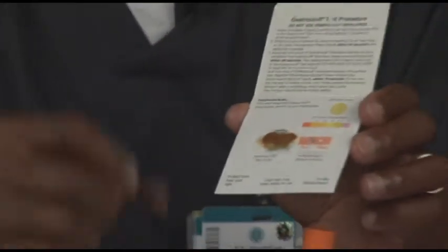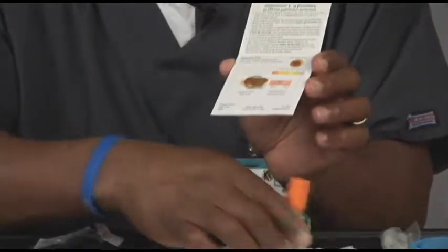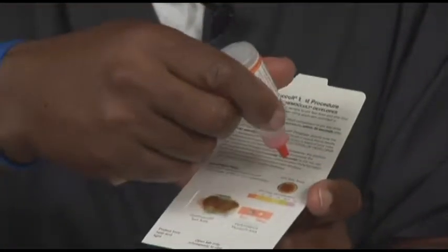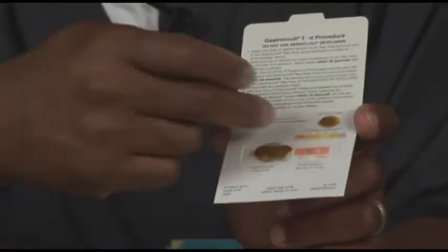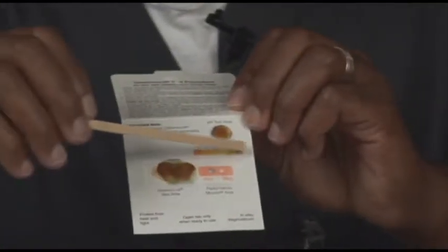Also, doctors may order a pH. You would have to smear some emesis in that round window, and you just place a drop of developer on that window and read the color change. And there's your reference as to the colors there. You just pick whatever color it changes based on that window there.